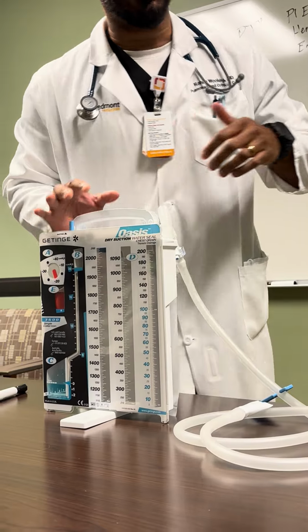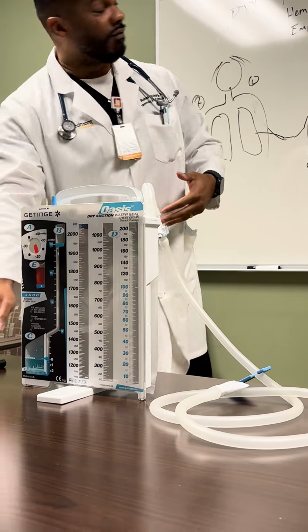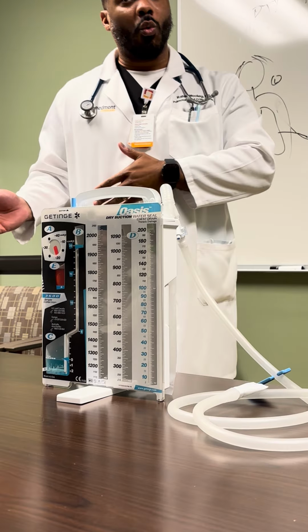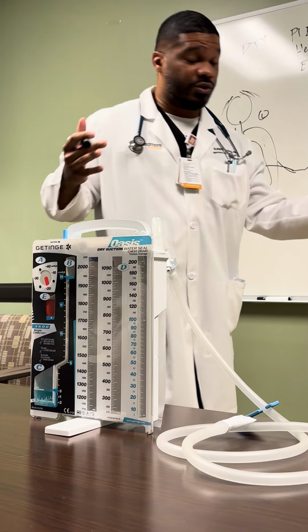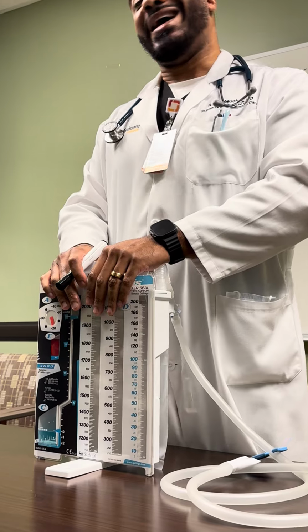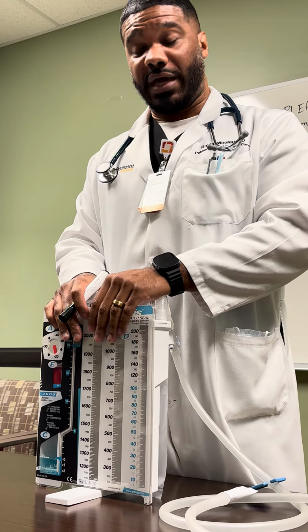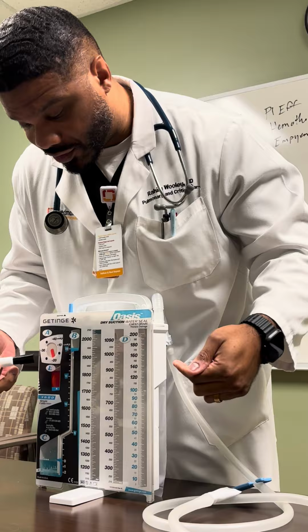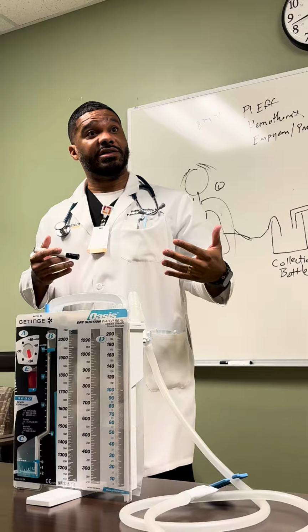And then, depending on what we have going on, after a conversation with the provider, we're either going to place this to wall suction, or we're going to place this to water seal, or we're going to do something else with it. But most times, 9 out of 10, probably 10 out of 10, we're going to place this initially to wall suction, okay?